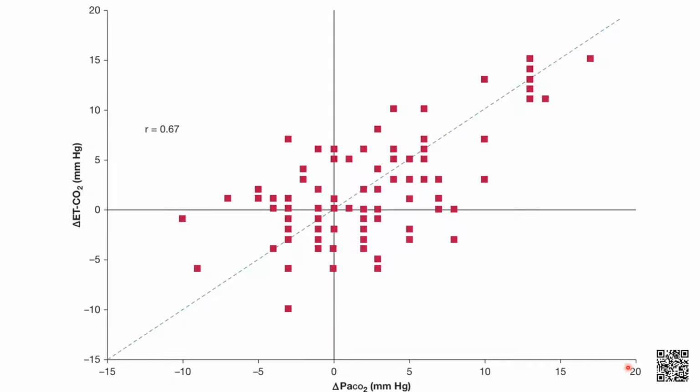But just as an example of some of the things that can affect the alveolar ventilation: the magnitude of dead space, VQ heterogeneity throughout the lung, the rate of CO2 production, vent expiratory time, the breathing pattern of the patient, the level of PEEP, changes in cardiac output. So there's a lot of reasons why you may not get reliable, consistent values when you're measuring end tidal and trying to correlate it to PaCO2. Again, if you're in a steady state condition, you're probably all right. But even if you're doing this on a patient with ARDS, there's going to be some degree of recruitment or some degree of alveolar collapse, and it's going to affect the way that the end tidal value is returned to the sensor.